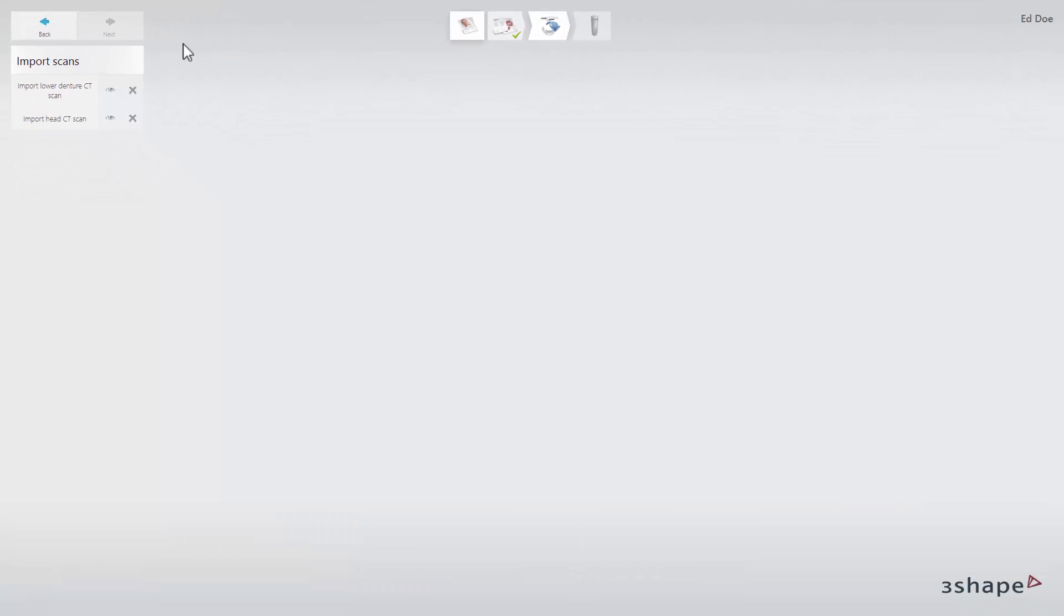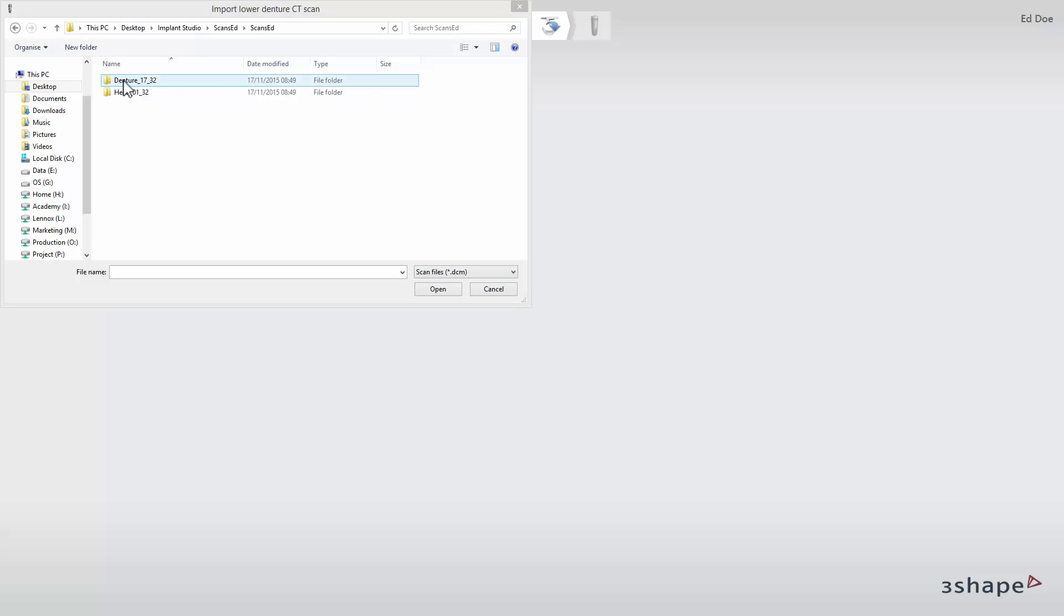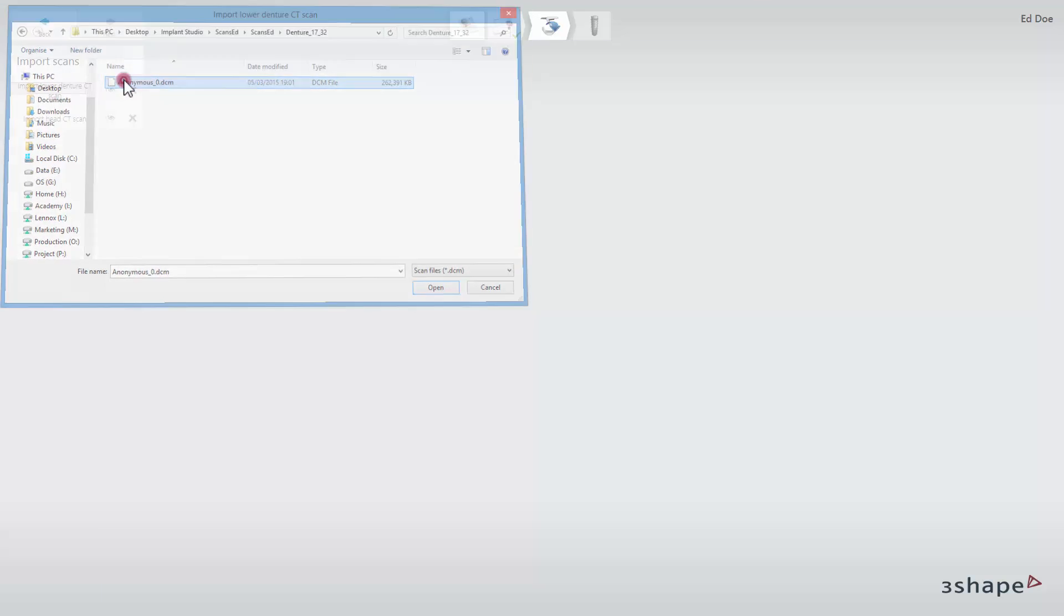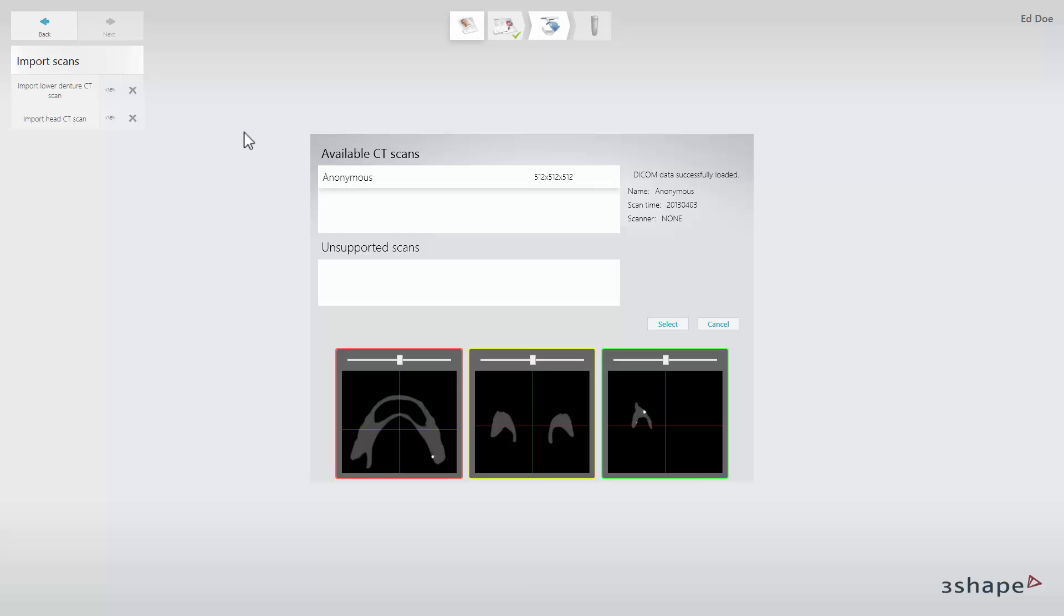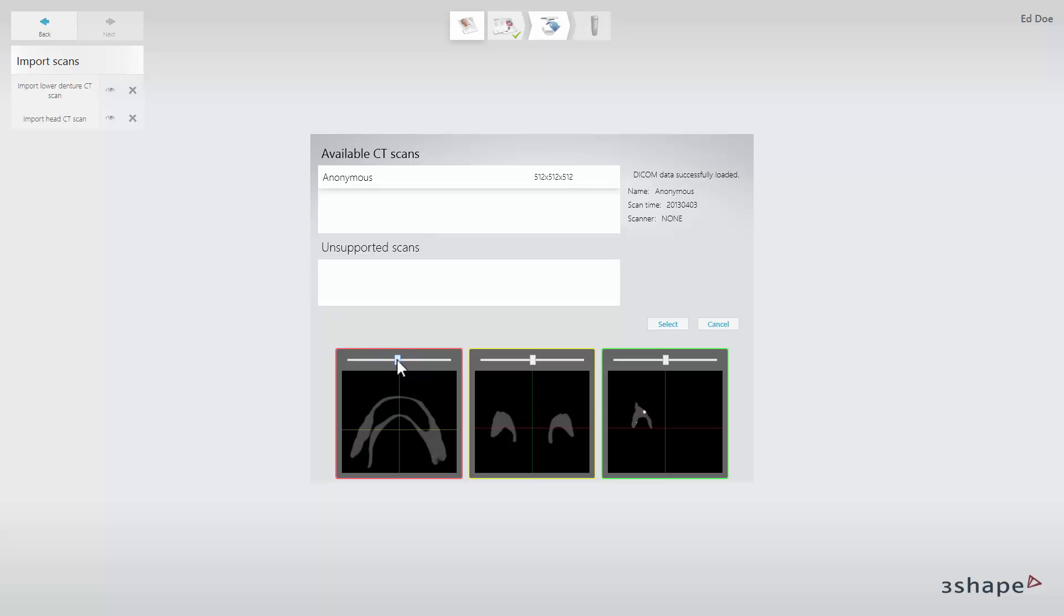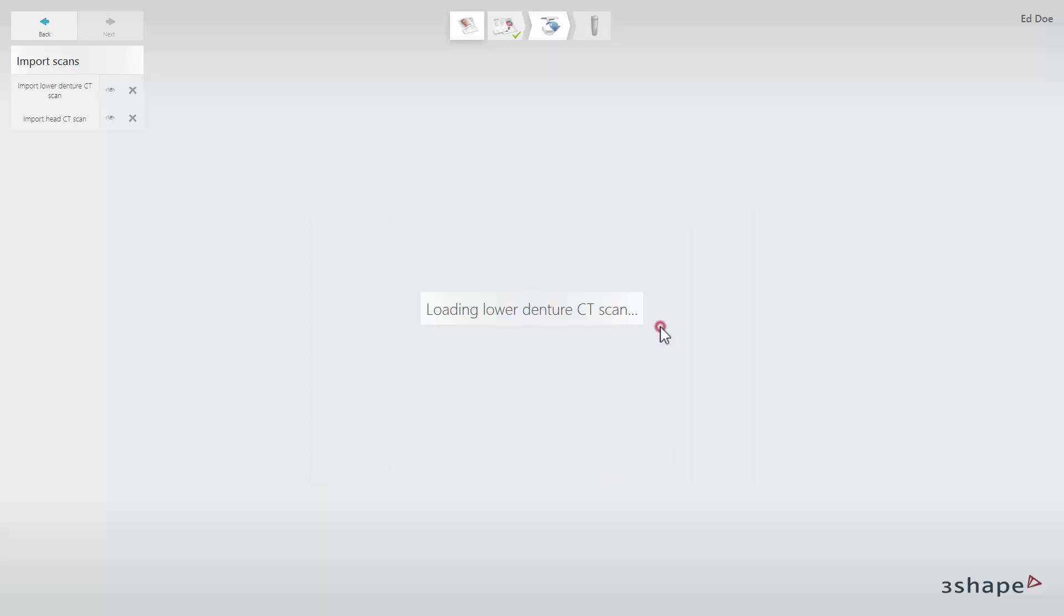Click the Import Lower Denture CT Scan button and browse to find the correct DICOM file. You can preview it in the pop-up window. Using the sliders, scroll through the content in the 2D cross-section. Click Select to load the scan.